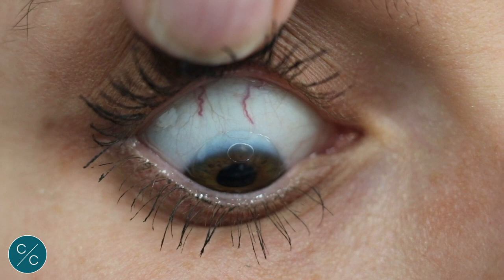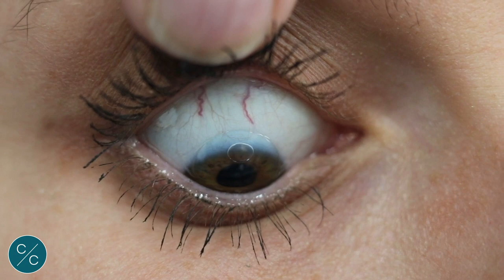I'll gently let go of the lid and if you have a slow blink, you'll feel the edge of the lens. If it starts to irritate, look down into your lap until it becomes more comfortable. Much more pleasant experience for the patient and for the practitioner — you don't have to chase lost lenses around the eye.